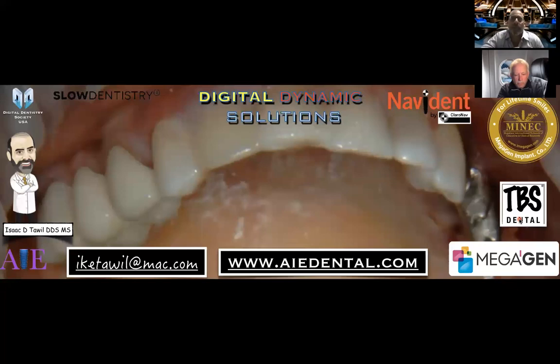However, if I am going to not graft a site and I'm going to come back later to place an implant, if I have a big ridge that I've grafted with a xenograft and I come back in and drill in reverse and compact that bone with osteodensification, what's going to end up happening is I'm going to compress all the vital bone that I've been developing, and I'm going to leave remnants of the xenograft bone.